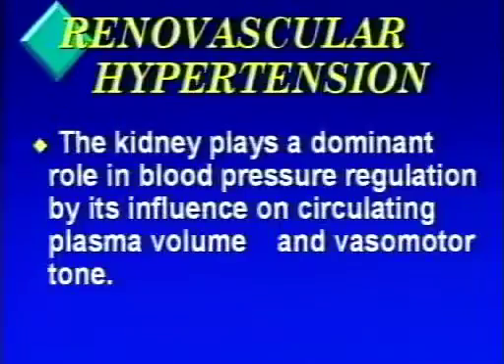Now, the reason that we would be performing a renal artery stenosis examination is to evaluate patients who have had a history of uncontrolled hypertension, and the physician is trying to find the source of that hypertension. In some patients, the hypertension is actually due to a renal artery stenosis. The kidney plays a dominant role in blood pressure regulation by its influence on circulating plasma volume and vasomotor tone.